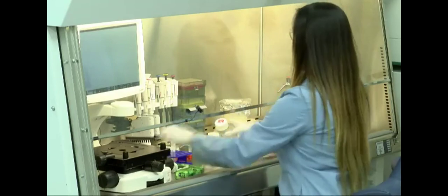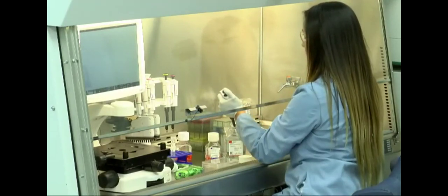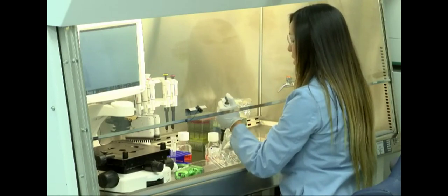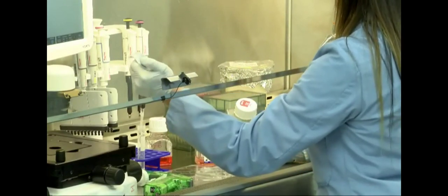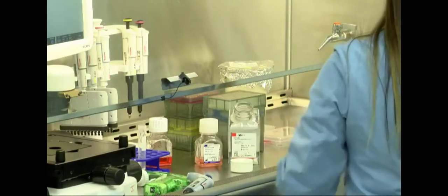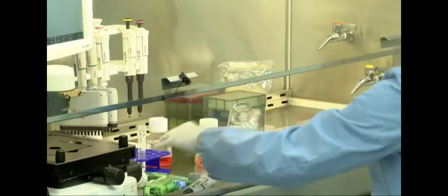So now from here, we're going to add 1 mL of our PBS minus minus to our well to inactivate the enzyme. And then you want to make sure you just kind of go around the well to get all the cell clumps off if you're not going to use a cell scraper. And then we're going to transfer all this to a 15 mL conical. And then we're also going to add an additional 5 to 10 mL, so I'm going to add 5 mL, just to make sure that enzyme is deactivated and we can get a nice wash of PBS minus minus.